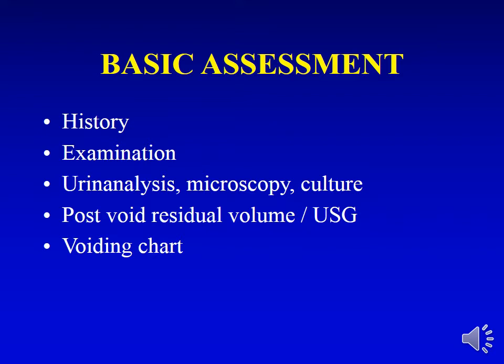We need to do a microscopy and culture, because if there's an infection, we shouldn't proceed with the urodynamic at all. We need to do a post-void residual volume to see how much urine has been passed out and how much is left back. Personally, I do both, pre and post void residual volume.